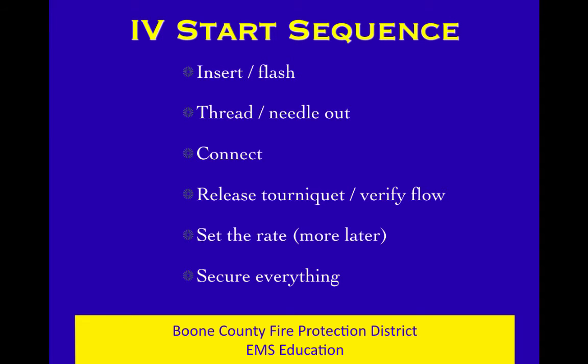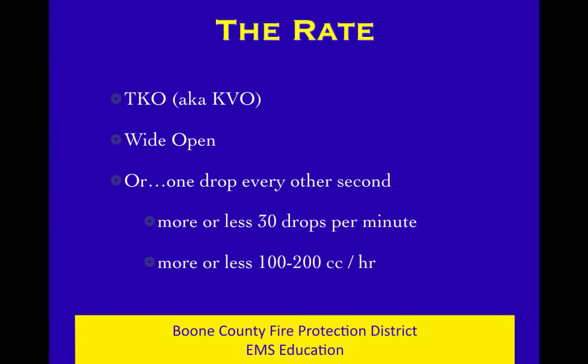And we'll talk about setting the rate here real quick. Now, this is quick and dirty. And so we're basically going to look at 3 rates right now. We're going to look at TKO, which means to keep open. I didn't invent these, I'm just teaching them. TKO, to keep open. Some places also use the term KVO, keep the vein open.